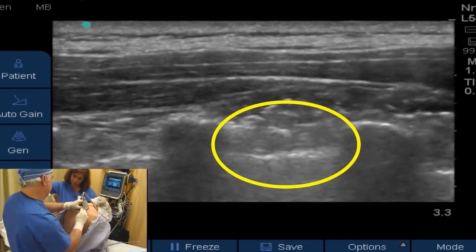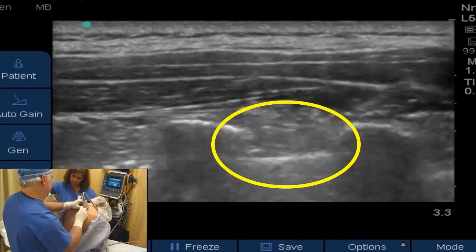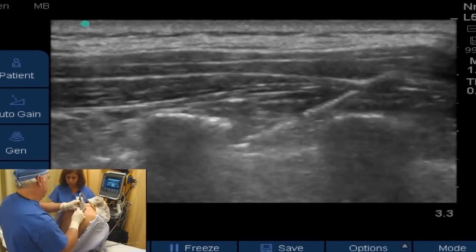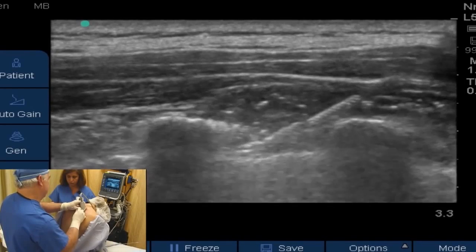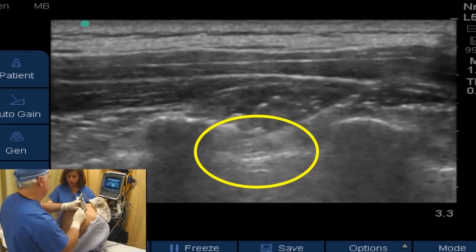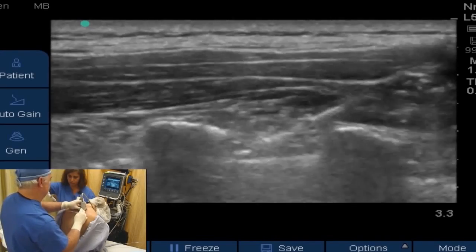Obviously we've got to be careful — you want to know where the pleura is and the tip of your needle at all times so that you don't advance the needle through the pleura into the lungs. You see the needle in this view very well. Now we bring our pleura back into view so we can see the tip of our needle right here above the pleura but below the costal transverse ligament, so we can deposit our local anesthetic in the space that we want it to be in.